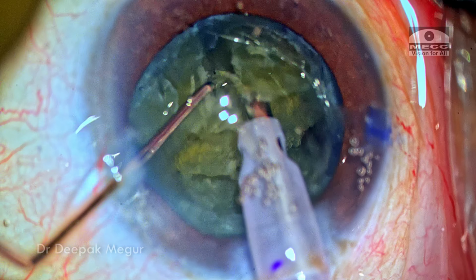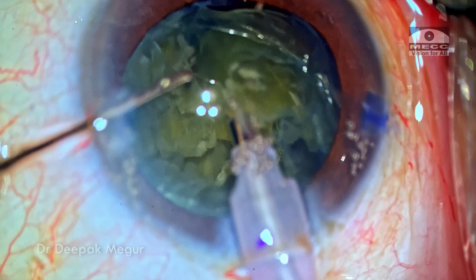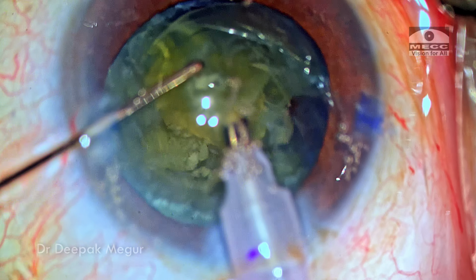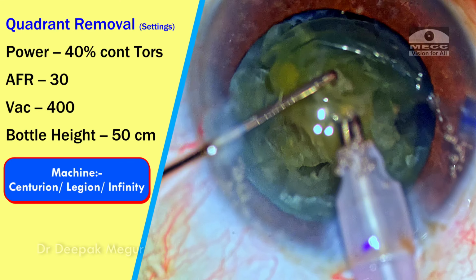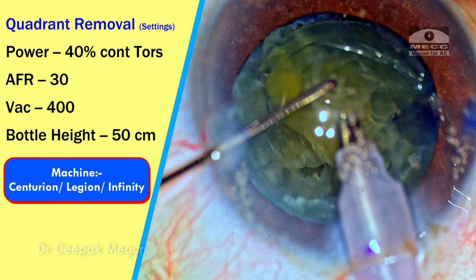The heminucleus is again divided into two smaller fragments, and then each of these fragments is pulled out of the bag and emulsified. Again, please note the settings here. Again, the bottle height is 50 centimeters, and the flow rate and vacuum are consistent with that. The flow rate and the vacuum are slightly reduced from my usual setting, just to compensate for the low bottle height which I'm working at.